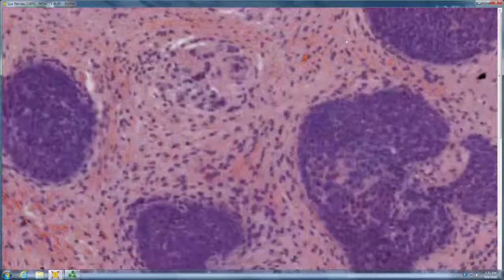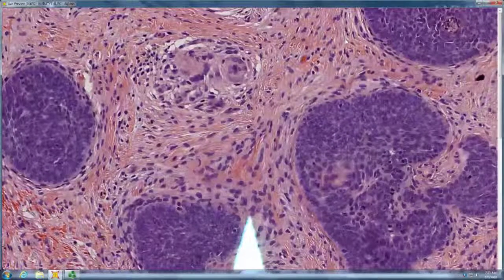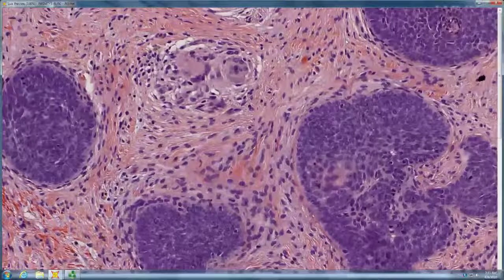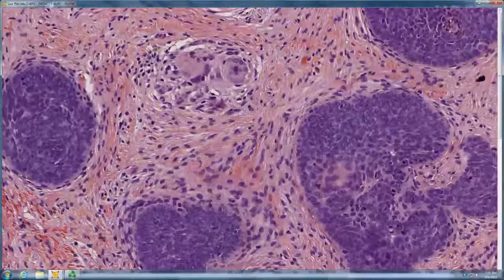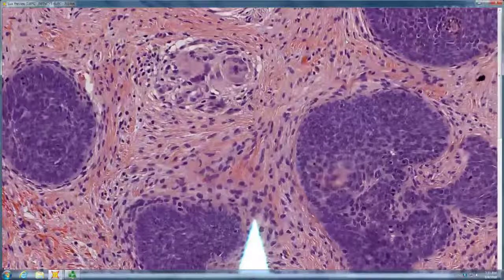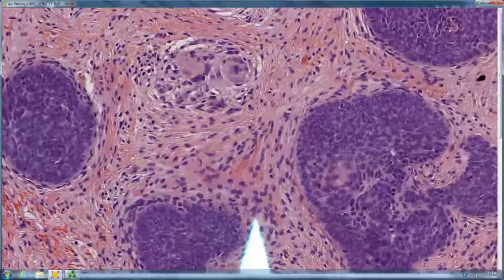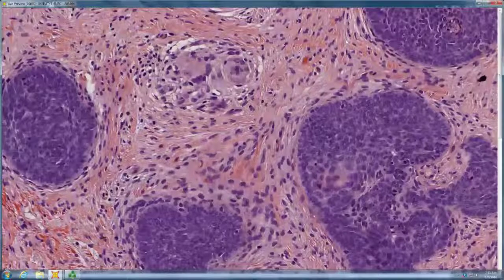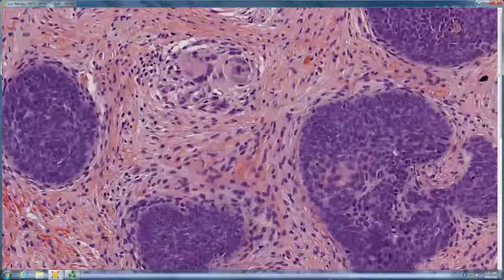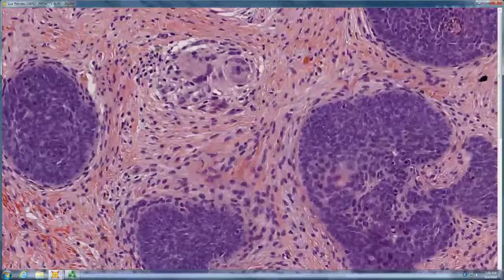What would you call such collections? What's the thing? Mesenchymal body. Yeah, papillary mesenchymal bodies, because they're like the mesenchyme that's in the dermal papilla of the hair follicle. And people who've done the online lectures point out that apparently I really like papillary mesenchymal bodies and point them out. But the stroma is what differentiates a benign pilar tumor from a basal cell. The basaloid islands themselves can look identical, right? So it's the stroma that tells them apart.